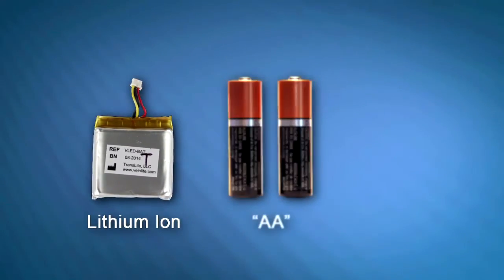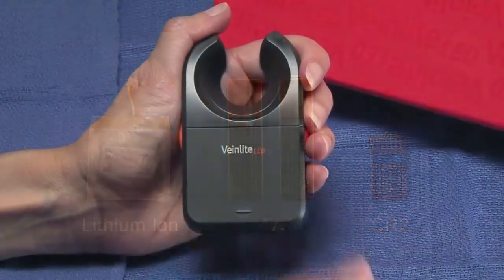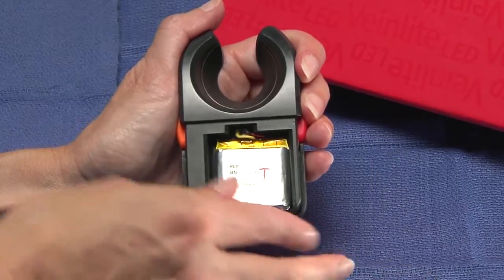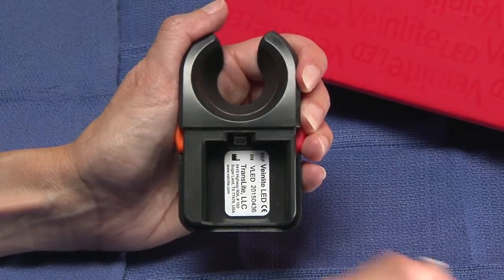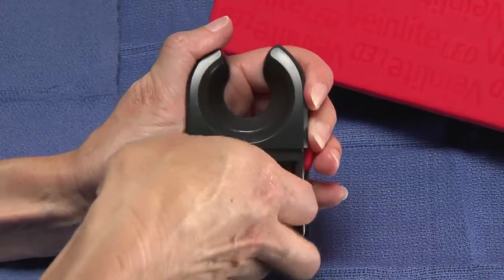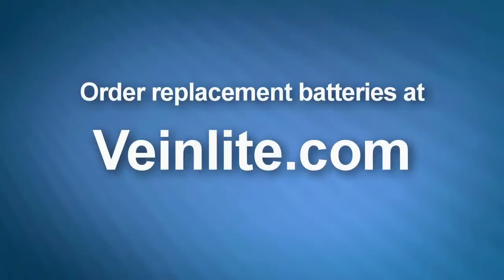Replacing the lithium-ion, AA, or CR2 batteries in your Veinlite device is fast and easy. Simply slide the cover off and lift out the battery. Some rechargeable batteries will have a wire connector that must be removed too. Replace the old battery with a new one and slide the battery cover back on. You can order replacement batteries for your device at Veinlite.com.